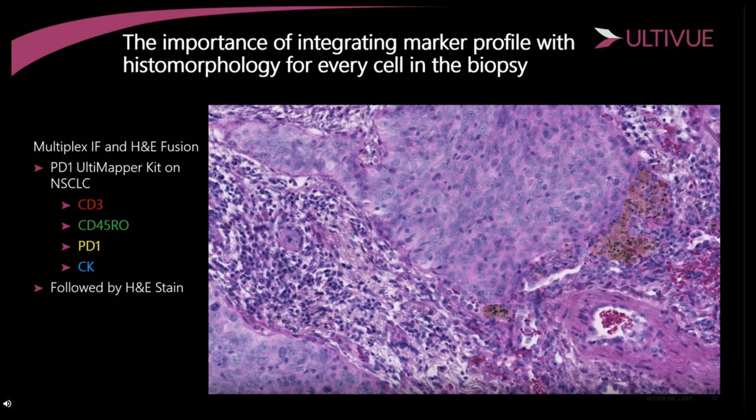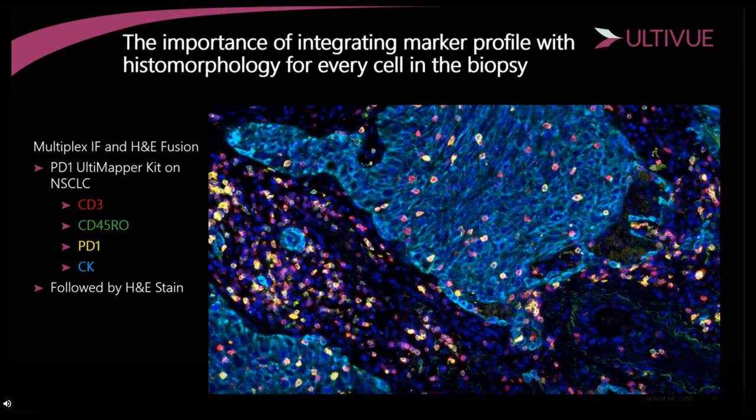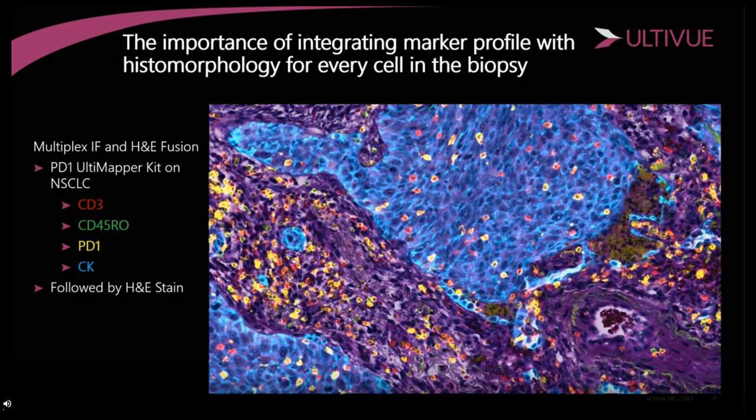What becomes complicated is saying what is the function of those cells and if those are exhausted T cells or if they are cytotoxic T cells. And this is where the additional IF data and information come in, and the combination of the two is really what takes the most out of a simple tissue that can be extremely precious.